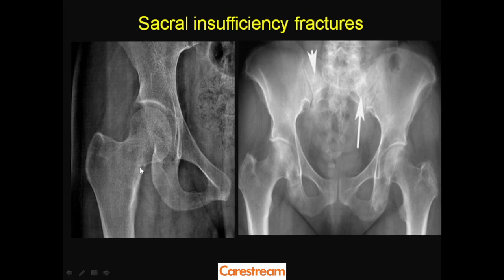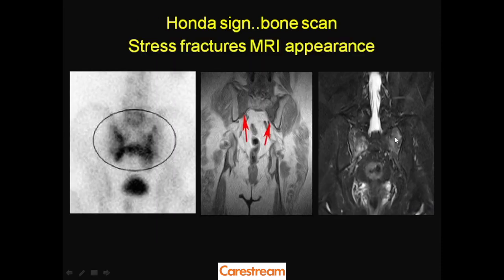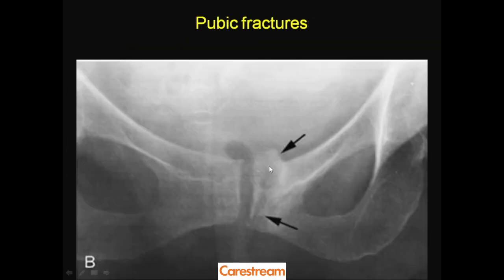Here is a real insufficiency fracture and a sacral insufficiency fracture. As discussed, since plain radiographs may be unrewarding for insufficiency fractures, MRI plays a role — showing diffuse edema on fluid-sensitive sequences and linear hypointensities perpendicular to the line of the bone on T1 sequences. Bone scan also plays a role: this bone scan shows the 'Honda sign' — a vertical fracture and horizontal fracture connected to produce an H-shaped pattern, classic of stress fracture in the sacrum.